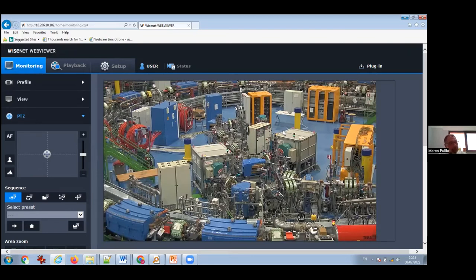And if you want to extract at the same time carbon and helium, the Betatron core is more suitable than RF knockout, because otherwise they would have two different frequencies. Well, I presume you can do it in both ways, but with the Betatron core, it's more natural. So I think we will use both, but the standard one will become RF knockout.